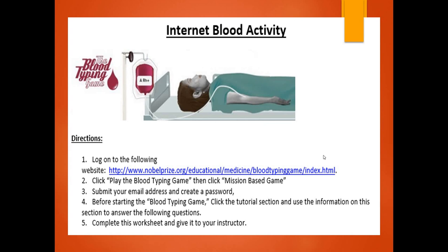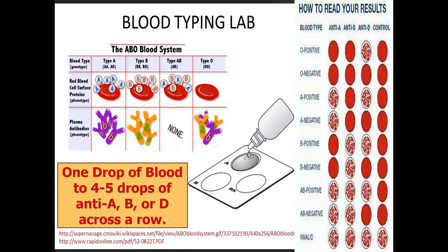Okay, let's finish up. Those that have finished can go back. I'm going to walk through the lab with you really quickly, so make sure you're watching and listening. Everybody back up here? All right, we're going to do the blood typing. You're going to have 3 suspects, a crime scene, a weapon, and a victim that you have blood from.